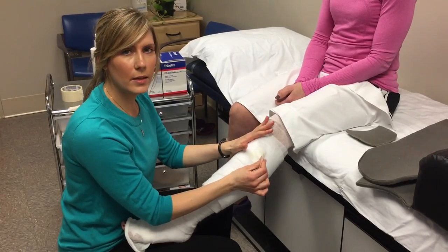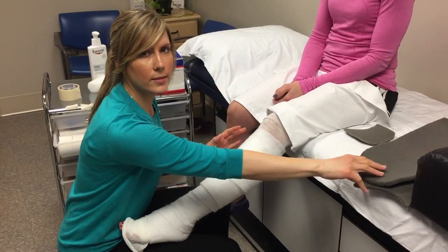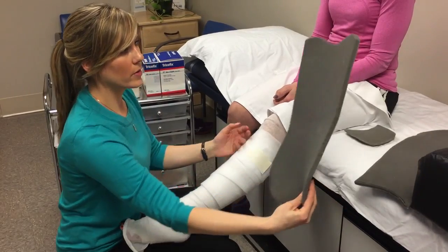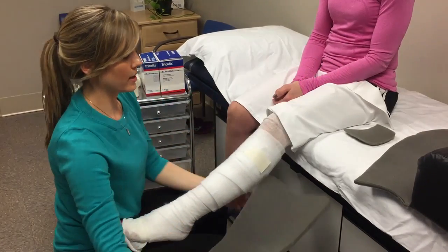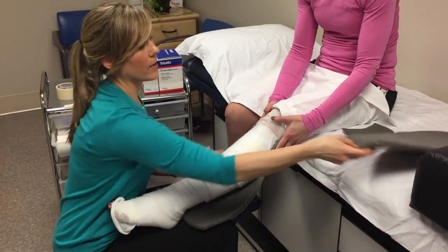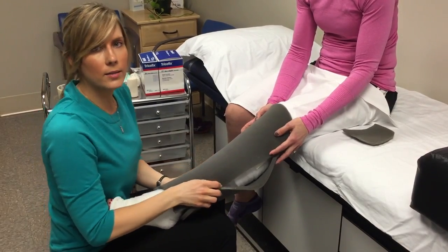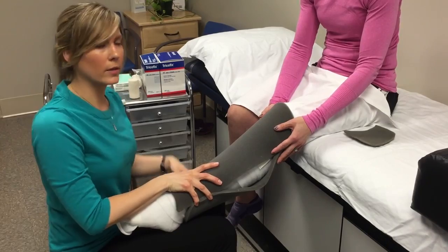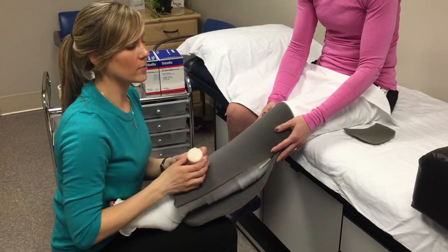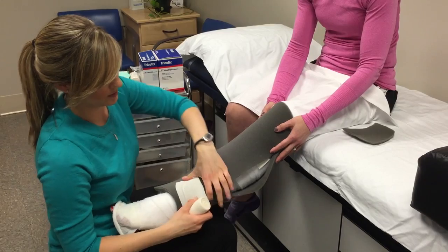Once you've gone all the way to the knee with your cotton padding, go ahead and use some masking tape to hold it in place, and now we'll place our gray foam pads that your therapist has already cut out for you. One goes for the back with the curve that goes behind the knee, and then place the front. We're just going to hold this in place with some gauze that doesn't apply any compression. We just want to make sure there aren't large air pockets between the foam and the skin, so just do a simple spiral to hold it in place.